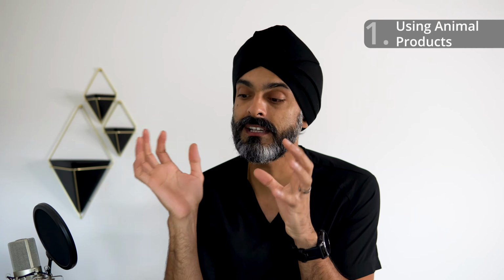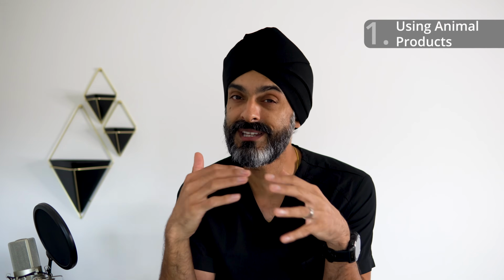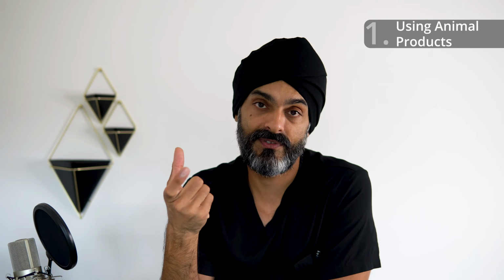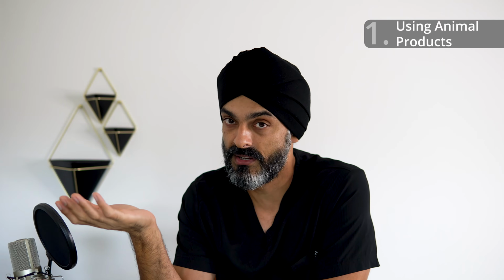Now, using purely animal products or products like this, there is a limitation on the amount of bone that we can get. You see, the first thing that has to happen is that blood vessels have to develop into this graft material. And then once we've got a blood supply, then all this healing can happen. But it seems from studies that there's a limit of 3 to 4 millimeters that blood vessels will grow into this bony material. So that limits the amount of thickness or the amount of height that we can achieve with this technique. But it has some really important advantages which we can't ignore.